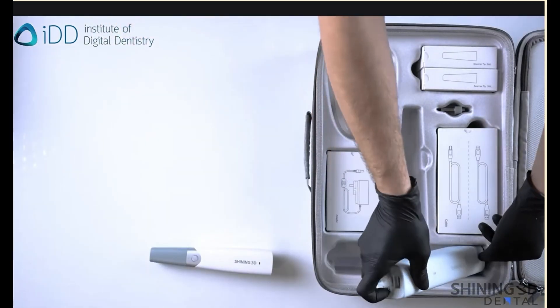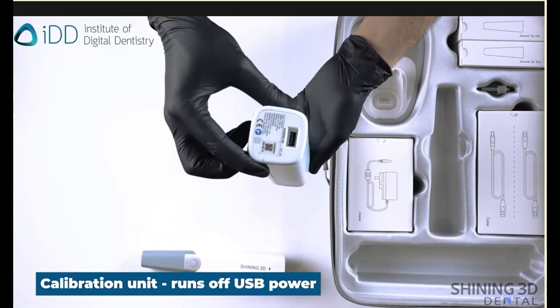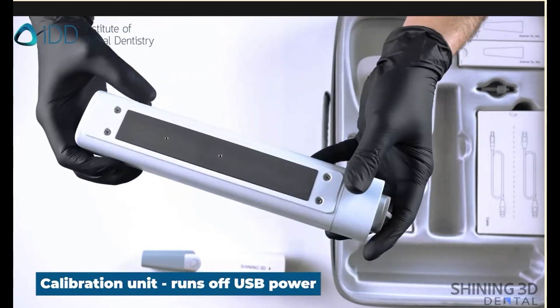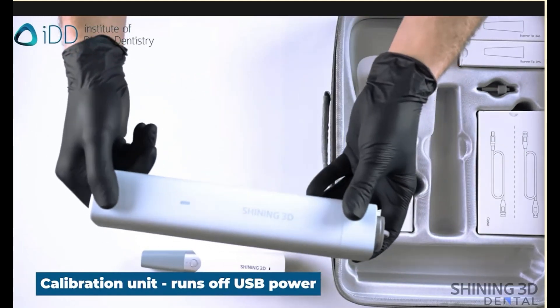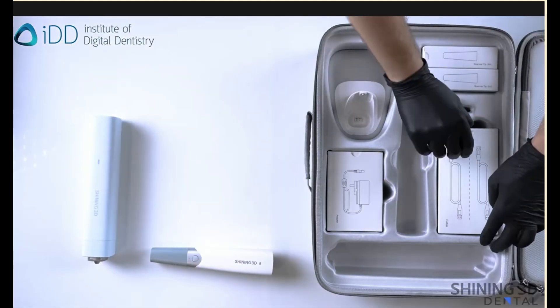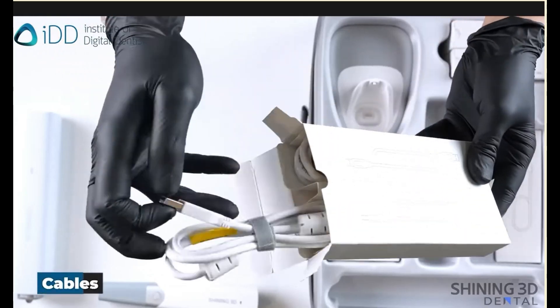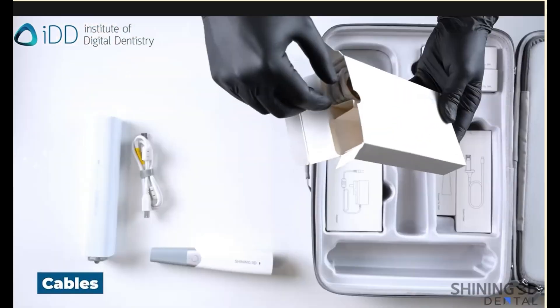Next is the calibration unit, which must be applied initially before the scanner is used, and then periodically repeated to ensure the accurate alignment of the scanner. Two power cables are supplied — one for the wireless receiver and the other for the calibrator.